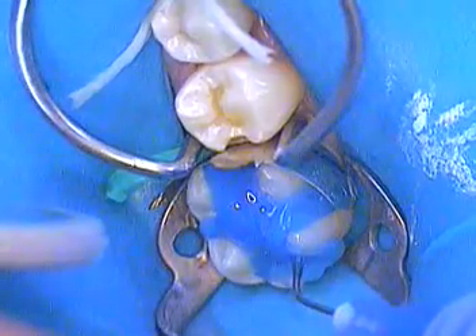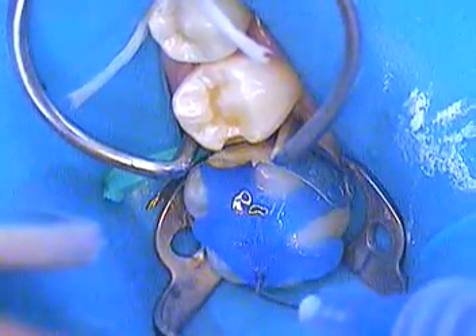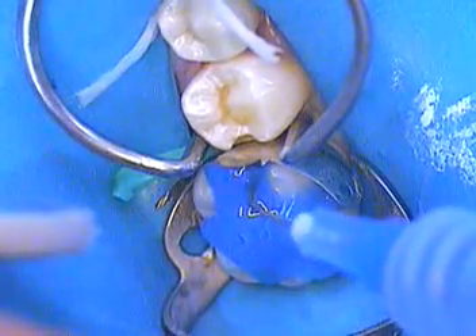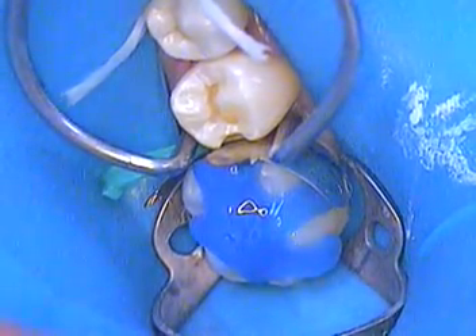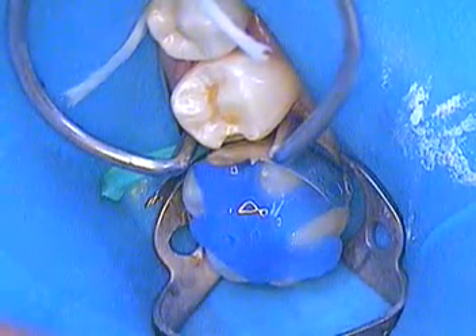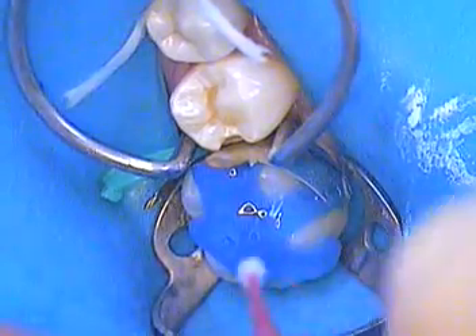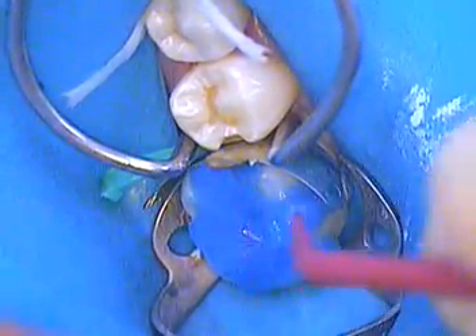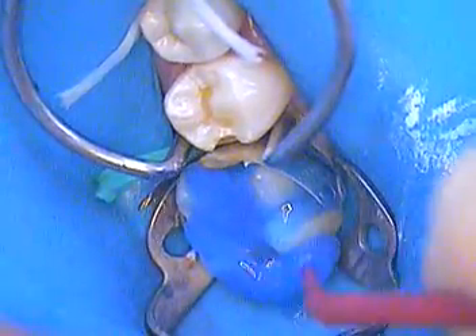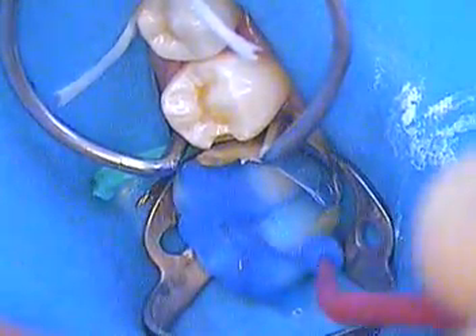I'll give it about 15 seconds on that. Many times you can see carbon dioxide being given off. I'm going to rinse this first and then we'll etch 29. I'm just rubbing the enamel here and agitating it a little bit.